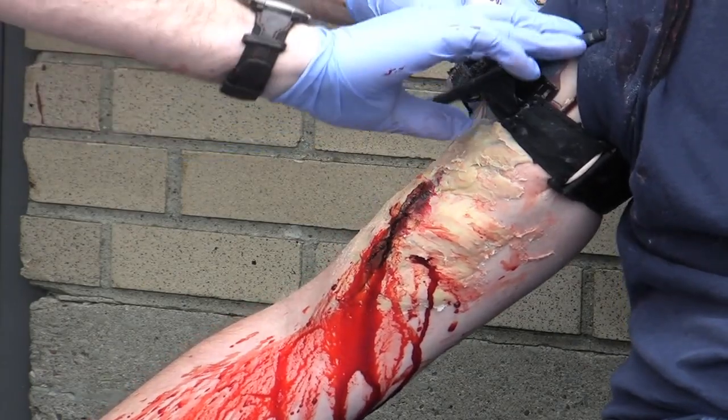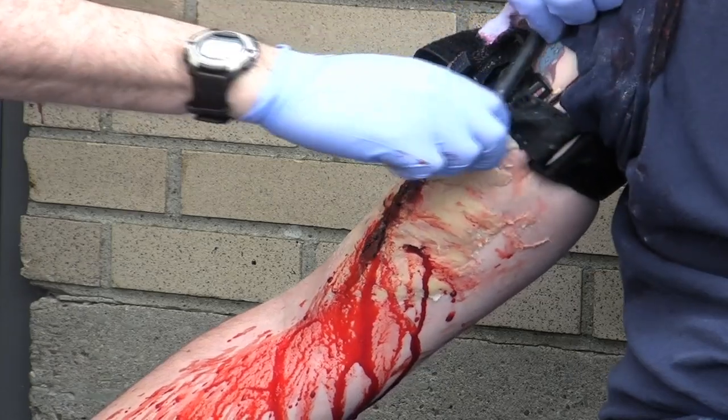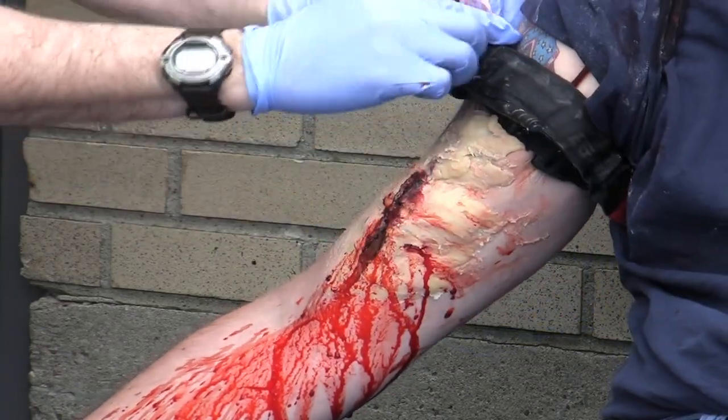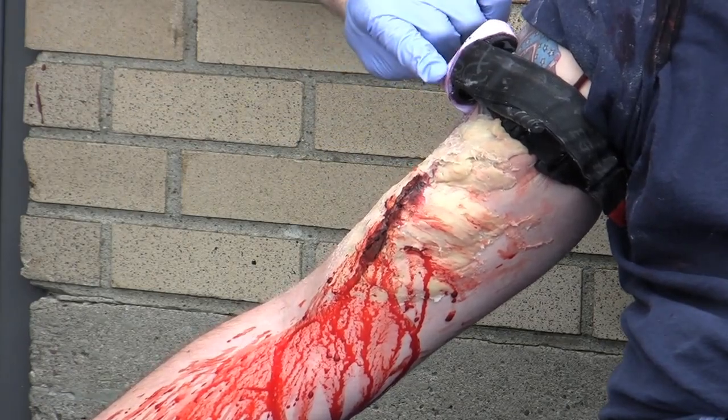Now twist the windlass rod until the bright red bleeding has stopped. Then lock the rod in place by using the windlass clip. Now bring the self-adhering band past the windlass clip and over the rod. Take the windlass strap and secure it to the windlass clip and record the time of tourniquet application.